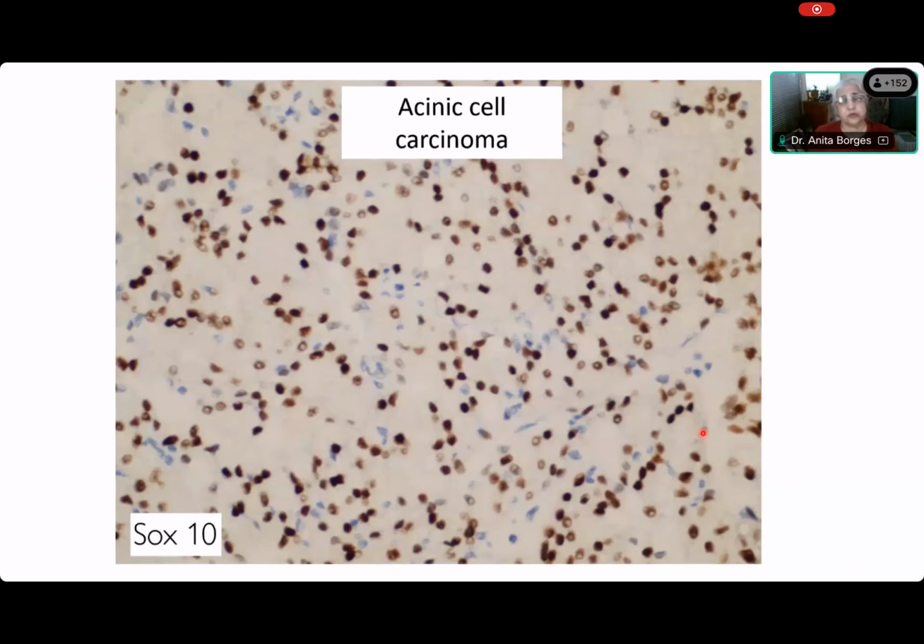Now tell me about this, Akshara. You said there are no myoepithelial cells, right? Yes, ma'am. So why is SOX10 positive? SOX10 can highlight the nuclei of acinar cells. They do highlight. So I showed you that the acinic cells all express SOX10. That is one of the expressions that we have to know about. So it is not myoepithelial cells in this tumor that are expressing SOX10, and you cannot be fooled by this into saying, oh, SOX10 is positive, therefore it contains myoepithelial cells. No, this is a constitutive expression of SOX10 in all acini, normal acini as well, and therefore this is not myoepithelial. This is an acinic cell tumor.